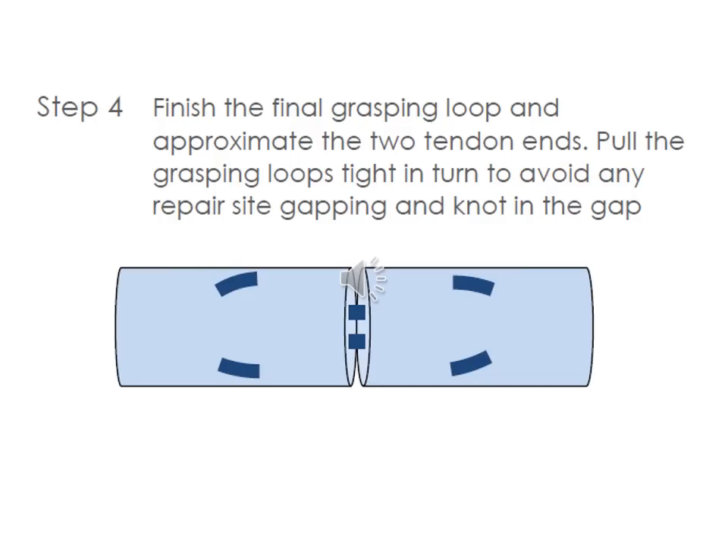Finally, the suture is finished by grasping the loops and approximating the two ends together, providing adequate tension to grasp those loops tightly. This will prevent any gapping at the repair site and the knot in the gap. Proline allows for this because it can slide easily as you are doing this procedure.